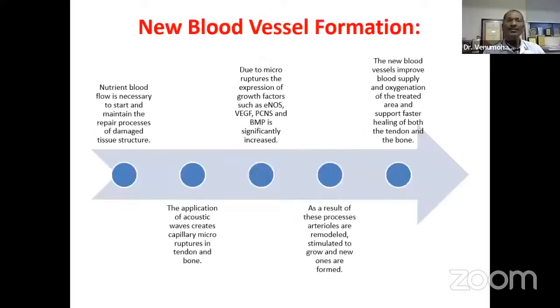Now let us see the effects of the shockwave therapy. So first, what we see is there is improved blood supply, which is very important for the repair process of any tissue which is injured or which requires healing. So the application of the acoustic waves creates capillary micro trauma in the targeted tissue. Then, due to this micro rupture, there is a release of the growth factors such as the endothelial nitric oxide, the vascular endothelial growth factors, etc.